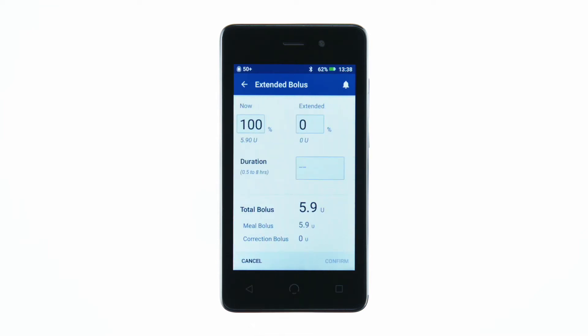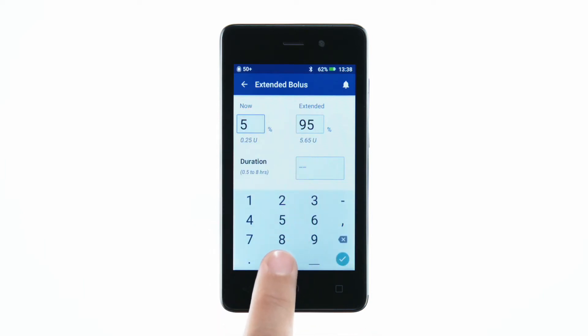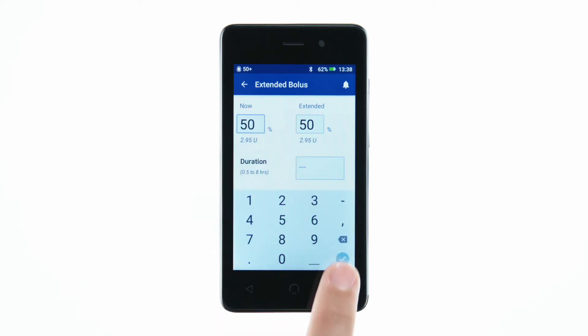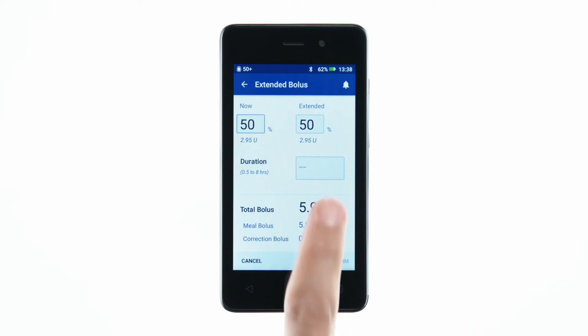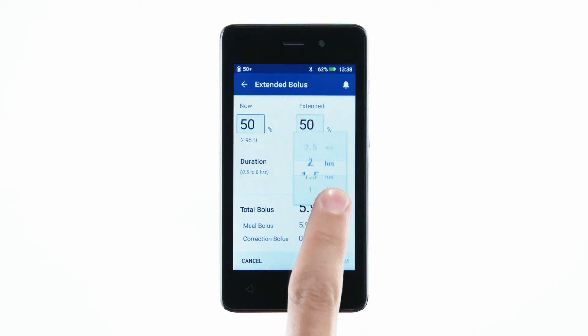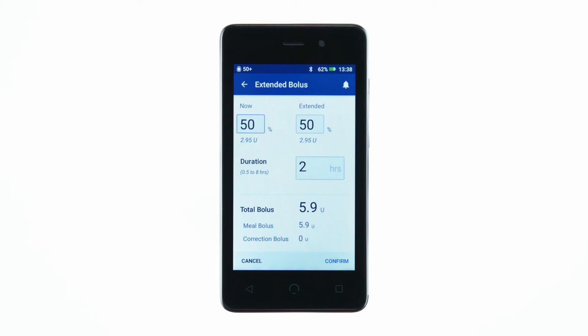Tap the Now field and type in the percentage of the meal bolus to be delivered immediately. Enter the duration for the extended portion of the bolus. Tap Confirm.